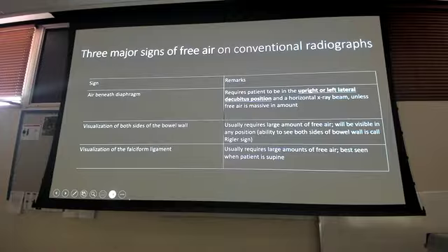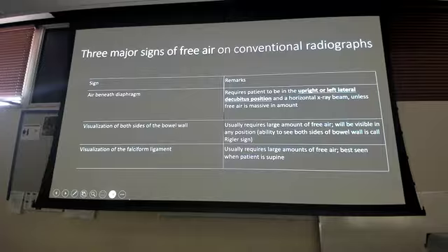When I talked about the lateral decubitus, if I tell you it's a left lateral decubitus, what side is lying flat on the table? Left lateral decubitus. The left side is on the table. It's named for side down, which means my right side is up. Okay. So I'm looking for air, right? So that makes sense. Why can't I do it the other way?